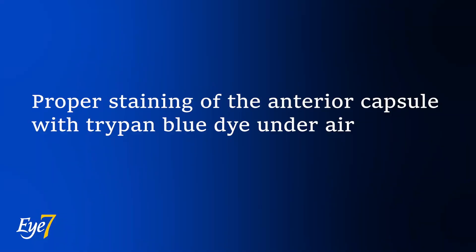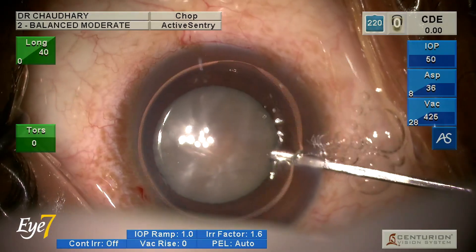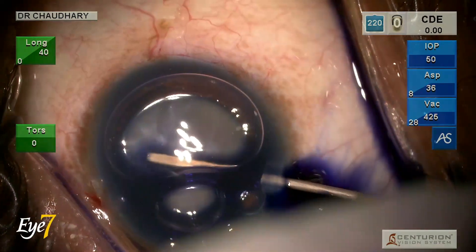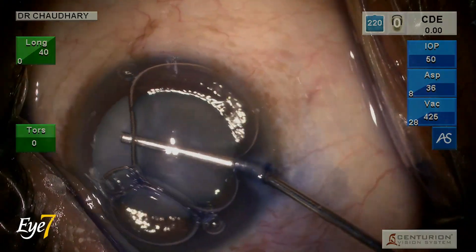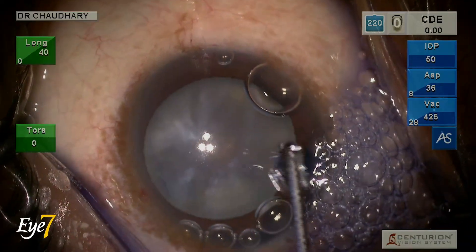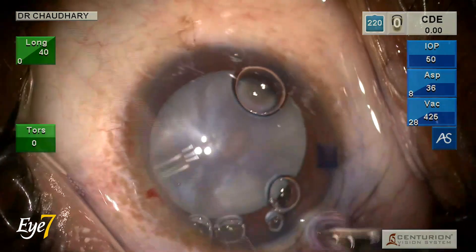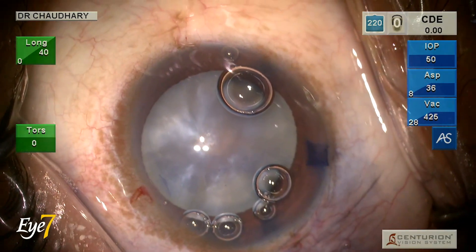Proper staining of the anterior capsule is of utmost importance in these cases so that the surgeon has a good view while making the rhexis. This is followed by insertion of viscoelastic to remove any air bubbles from the anterior chamber, after which a 2.2 mm keratome is used to create a bi-planar main port incision.